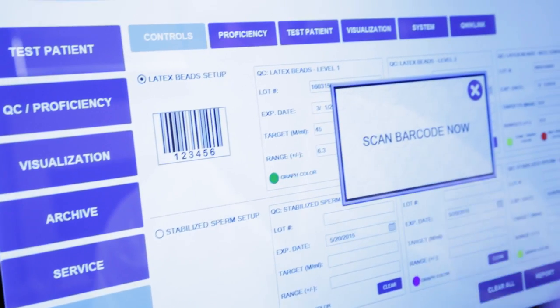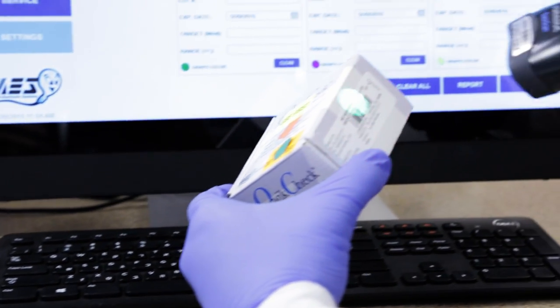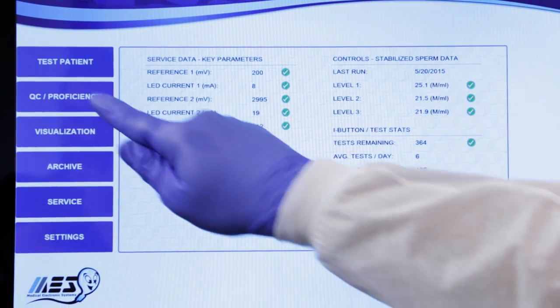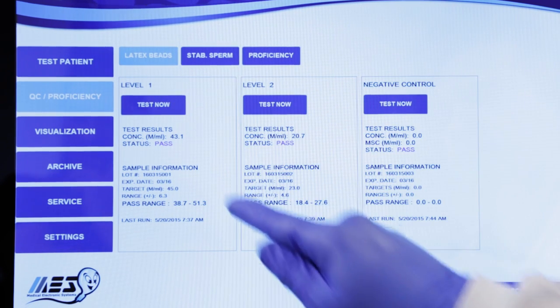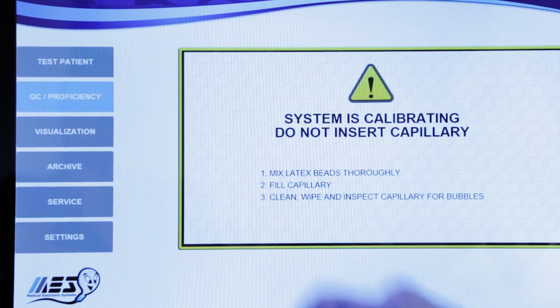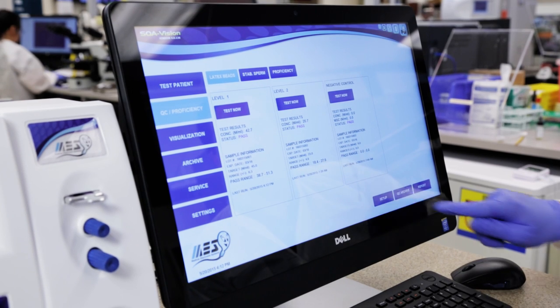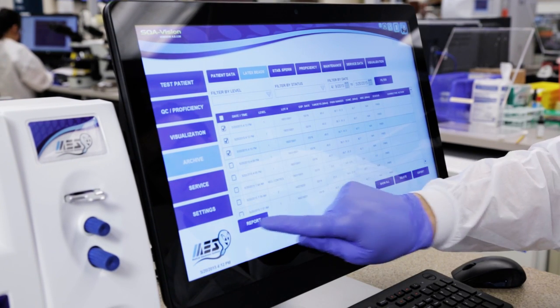System setup is a tap away and the included barcode scanner makes quick work of data input. Quality control and proficiency testing on the Vision is a snap. Based on time intervals you define, the Vision lets you know when QC is due. One touch later and you're on your way. Results are permanently saved and a variety of reporting and archiving options are available based on your requirements.